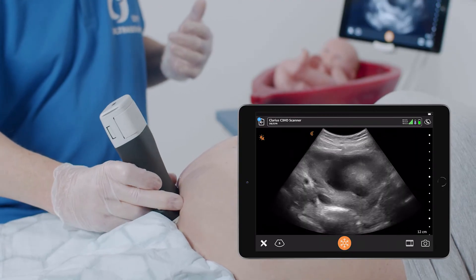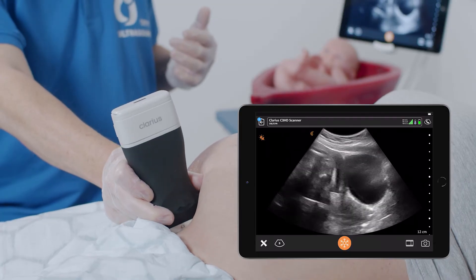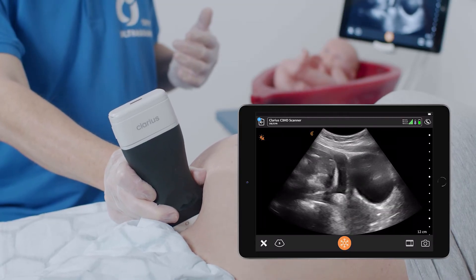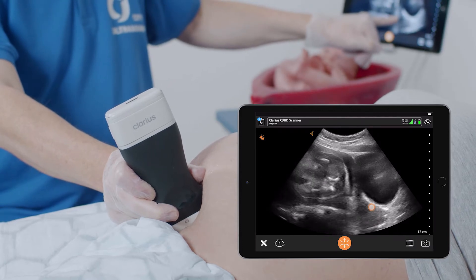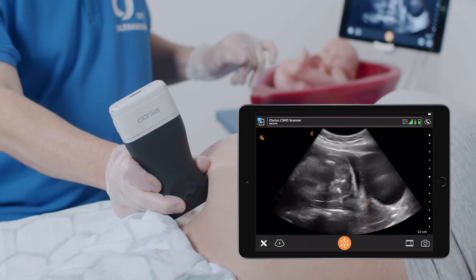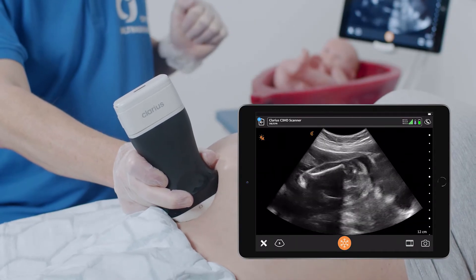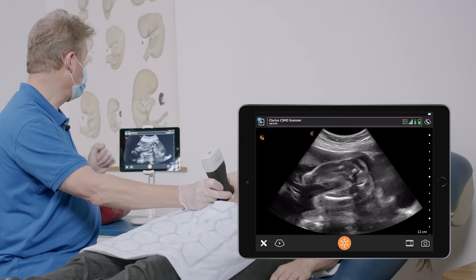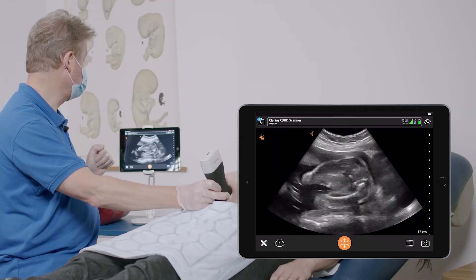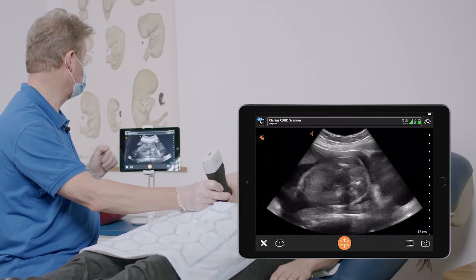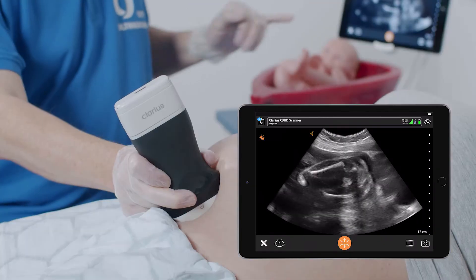I'm rotating my transducer 90 degrees in order to identify the internal os and cervix of the uterus. Then I am moving up in order to understand what part of the baby I can see. I can already see a few landmarks that indicate breech presentation.